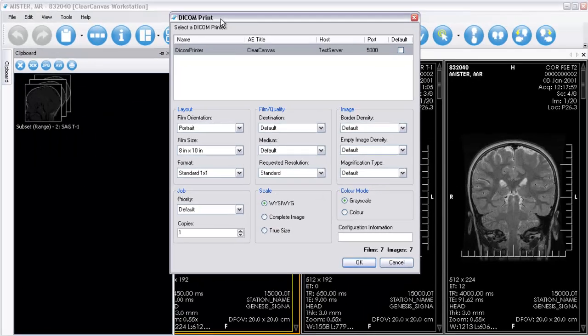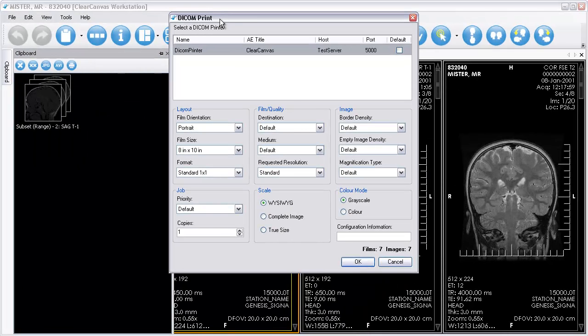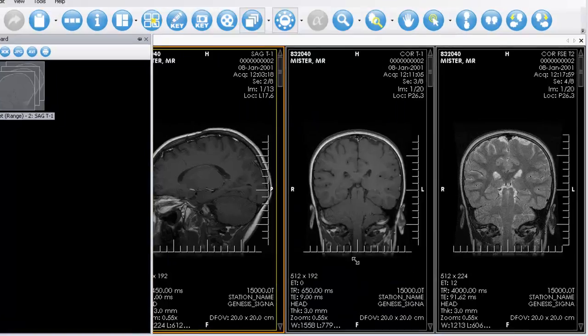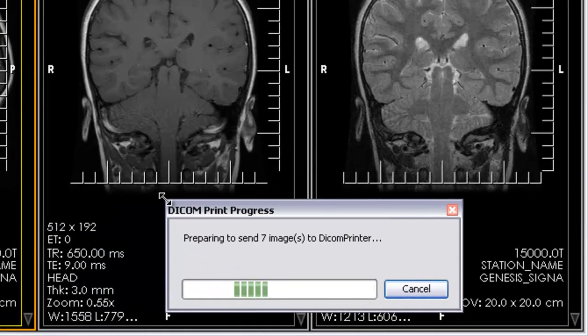The Dicom Print dialog will appear where you can finalize your printing options. Click OK to send the images to the printer.